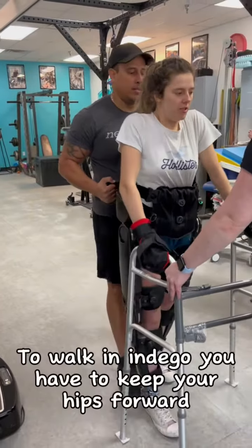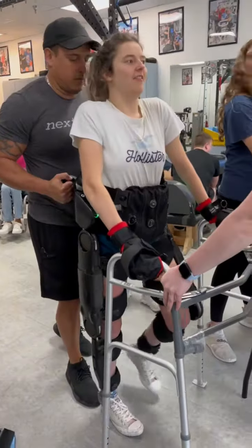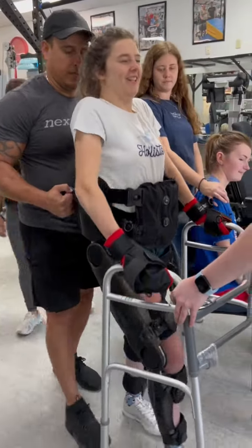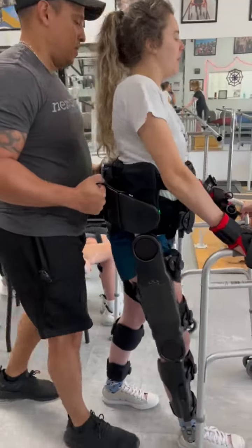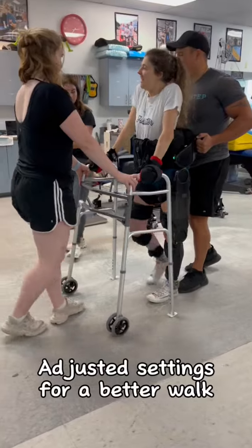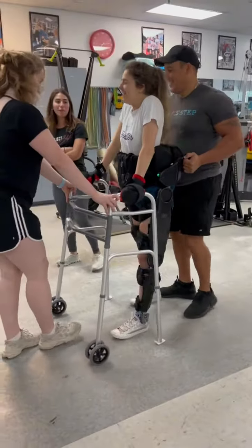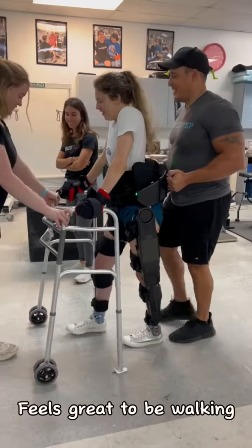Each robotic exoskeleton has a slightly different walking feel. To walk in Indego, you have to keep your hips forward. Adjusted settings for a better walk — feels great to be walking.